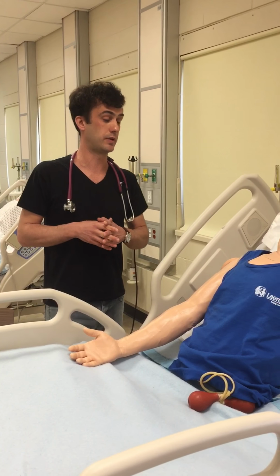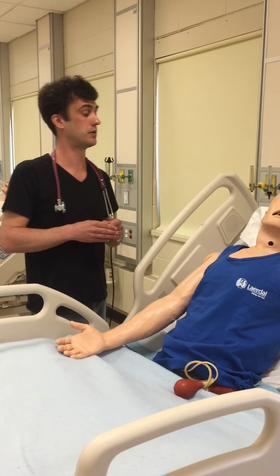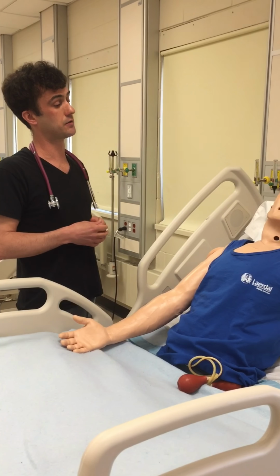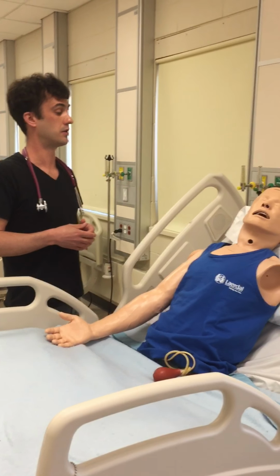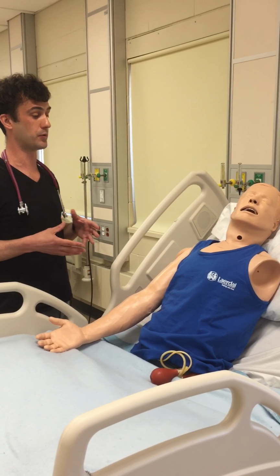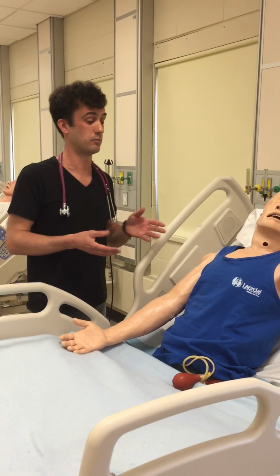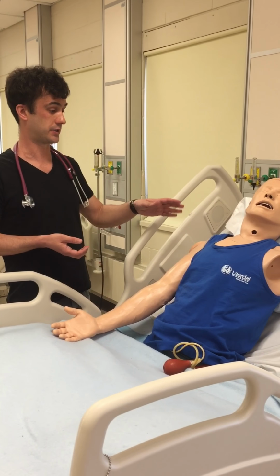I would then explain to the patient the procedure that I'm here to do. I'm going to give you a breathing treatment of albuterol, which is a bronchodilator, and the goal of albuterol is to open up your airways and hopefully make you breathe a little bit easier. I will then confirm with the patient that he understands what I had just explained to him.